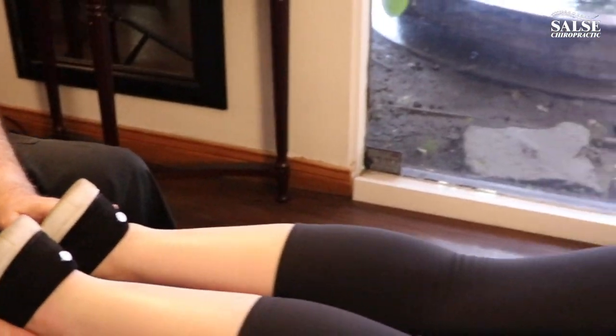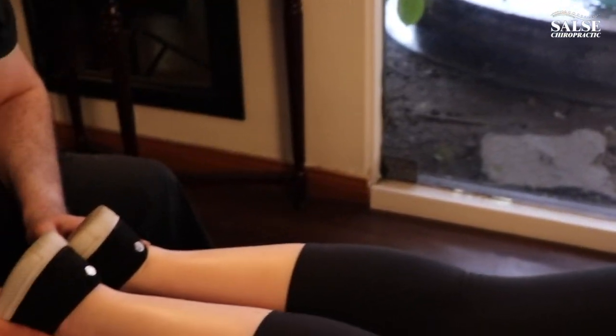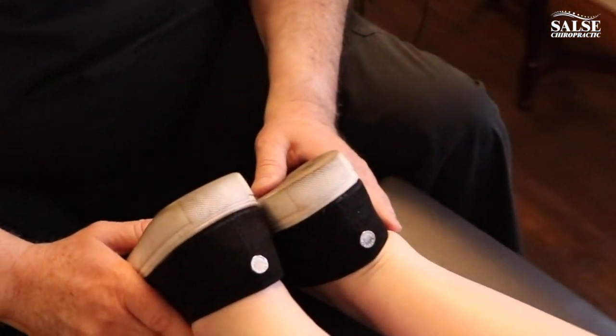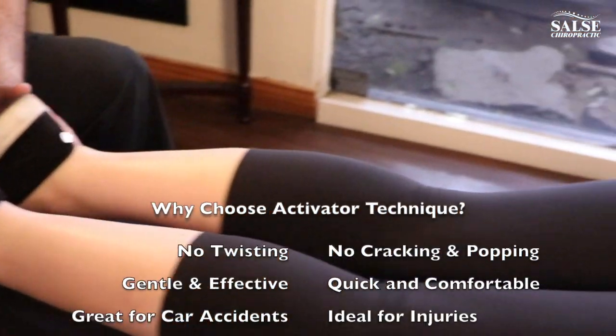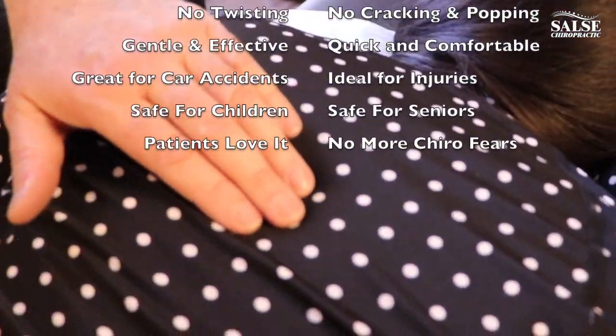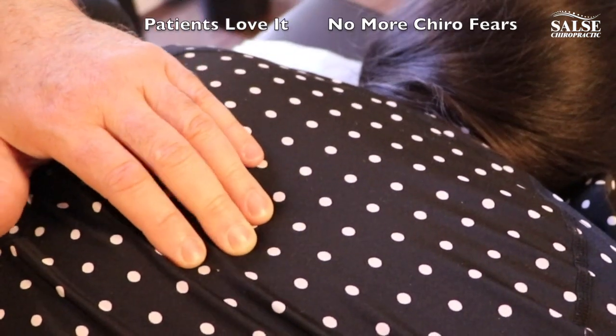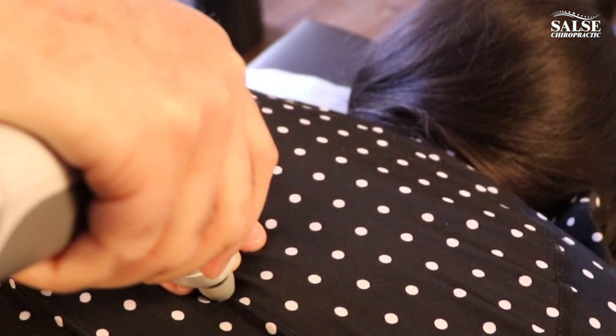Now go ahead and turn your head to the left — you can see quite a shift there when she turned her head to the left. Now put your head back to the middle and we'll go ahead and release the T6 right here. So this is T6 right here, and that's all it is.